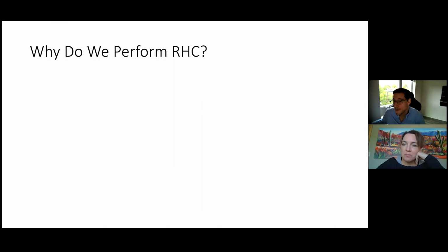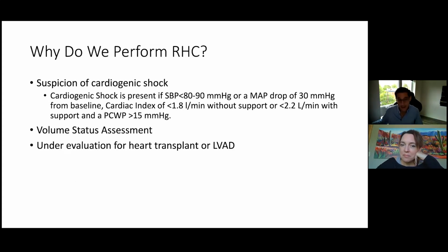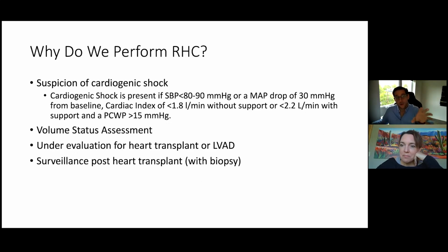Why should we perform a right heart cath on this patient, right? Me sincerely, I feel we should, just to see her volume status and her hemodynamics. But this is again the slide of why do we perform right heart cath, and there's the why do we do them, right?